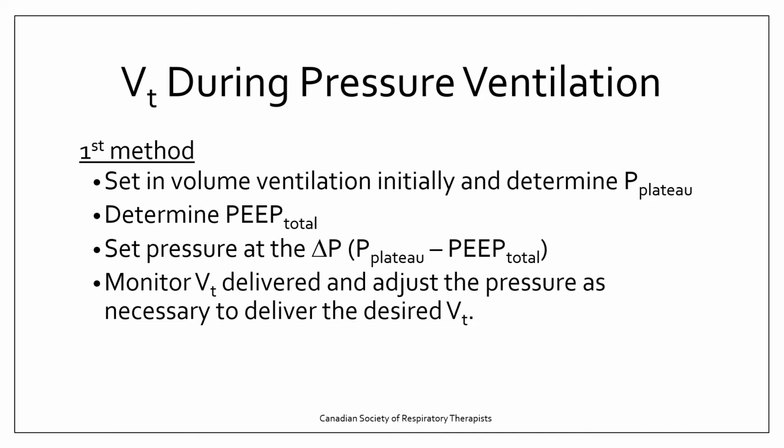So we take our plateau pressure and we subtract our PEEP, and really that's indicative of, from our baseline pressure to what our plateau pressure is, that pressure difference between the two, that's indicating what the alveolar pressure is, so how much pressure is in the lungs for that set volume that we inputted in volume control. So for example, if it's 450 mils and my plateau pressure minus my PEEP is 20 centimeters of water pressure, then it takes 20 centimeters of water pressure to inflate the lungs to 450 mils, to have 450 mils of volume within our lungs.